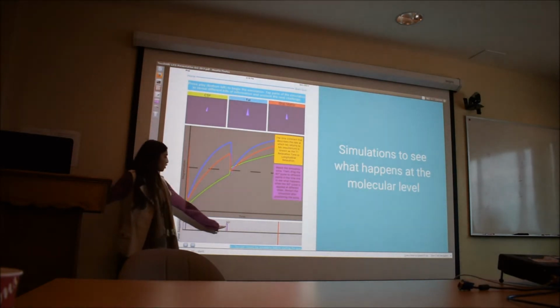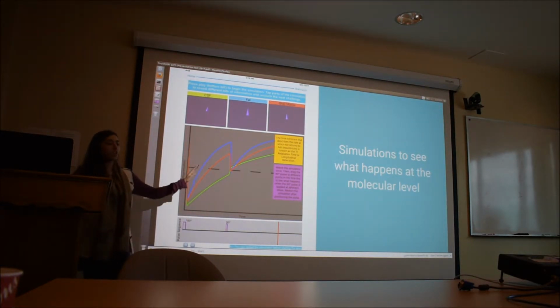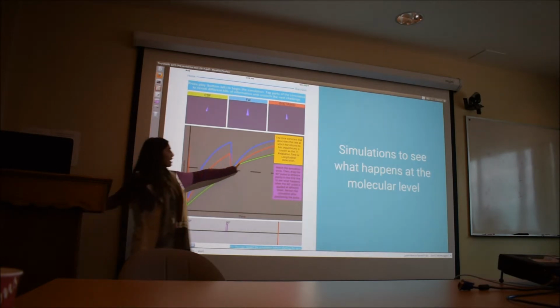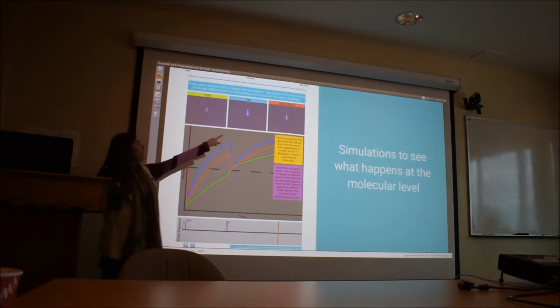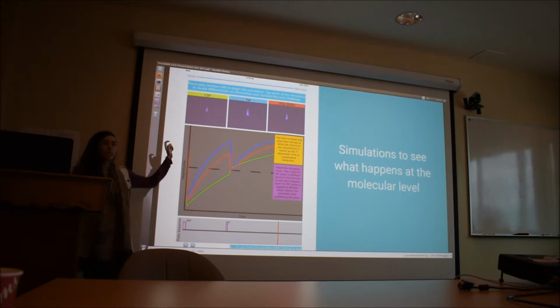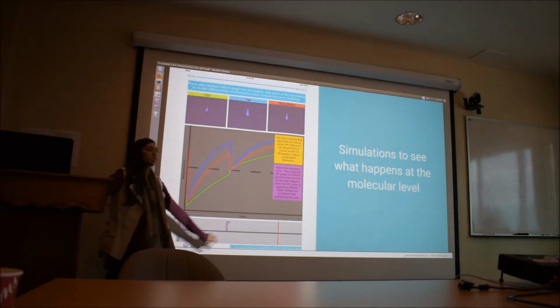Once the 90-degree pulse has finished applying, the cones will relax back into their original position, but they rotate as they go along. The speeds at which they rotate vary based on the different tissues, which is why they relax back at different rates. The user can play the simulation as many times as they want. They can tap on the different cones to get the actual relaxation times of each of the tissues. Following the simulation, we have a second simulation, just like this, except there's an extra graph that maps the signal after the 90-degree pulse has been applied.